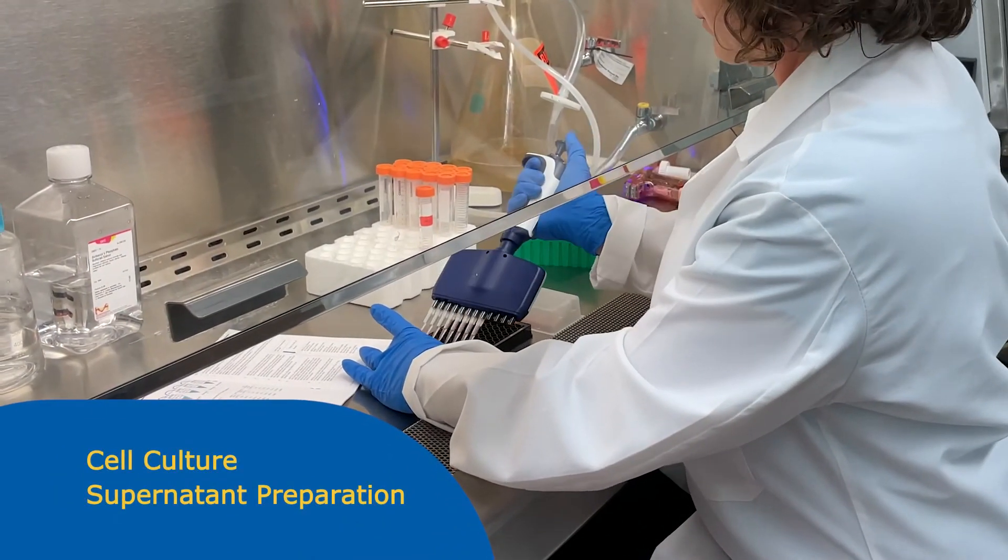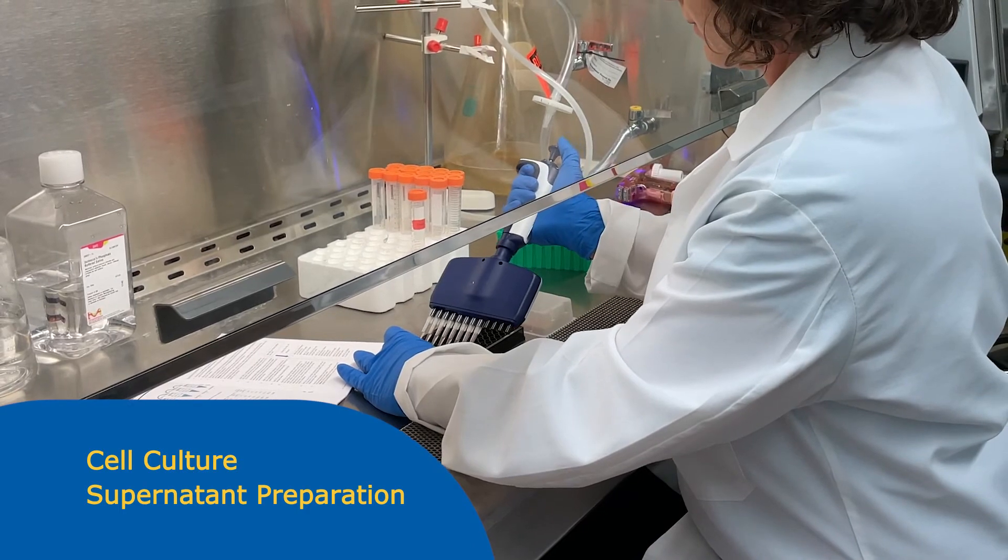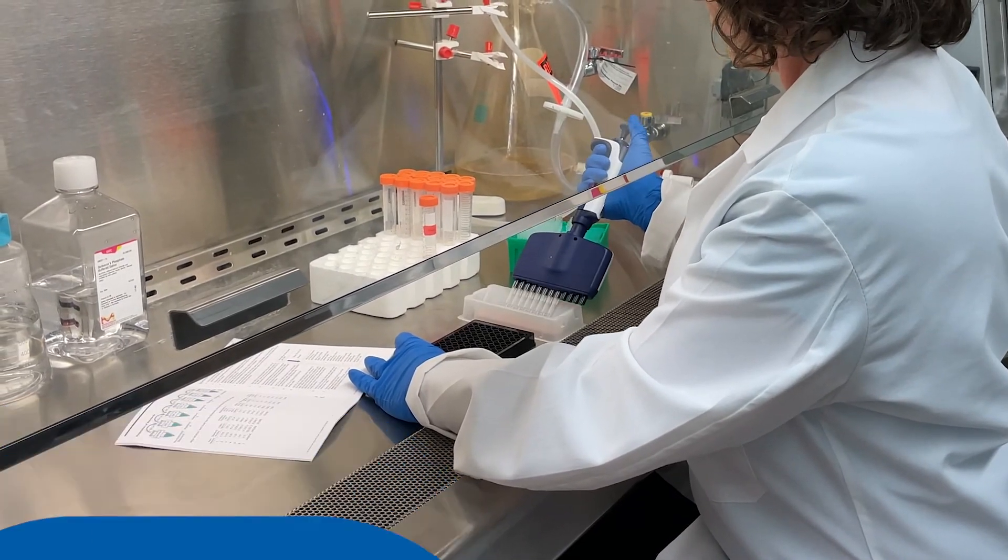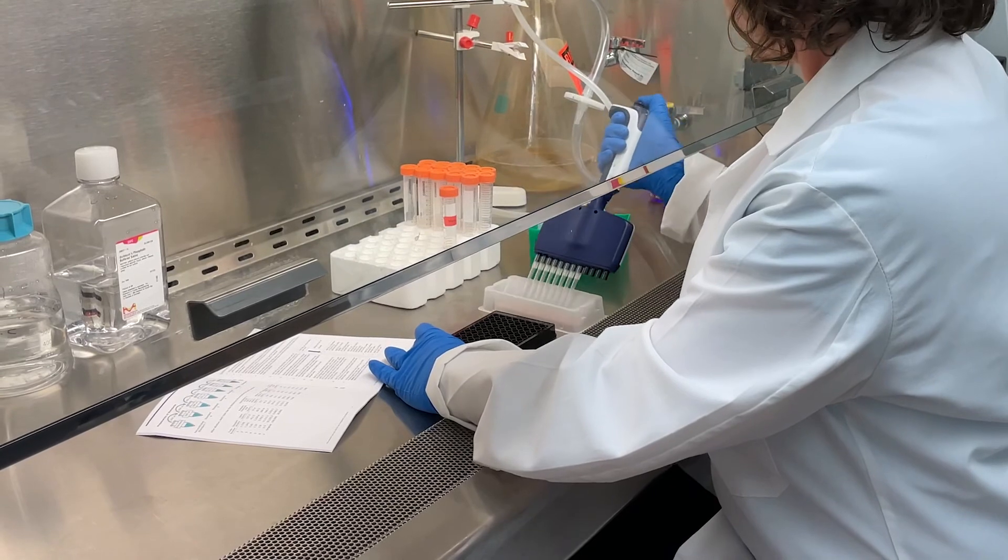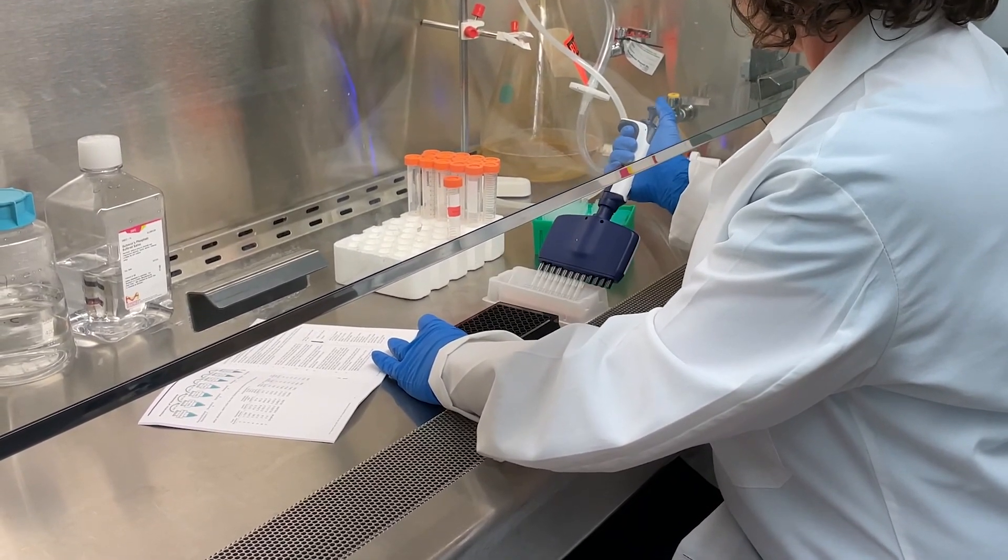Cell culture samples should be centrifuged to remove debris and assayed immediately or stored at minus 20 to minus 80 degrees Celsius until needed. Fresh culture media should be used as the matrix solution in the blank, standard curves, and control wells.